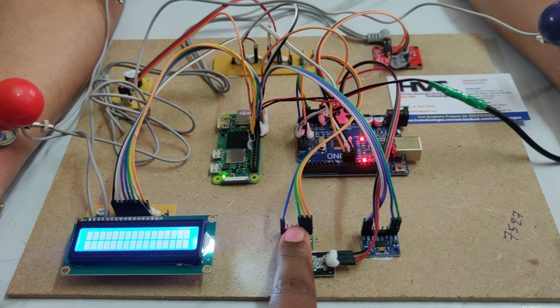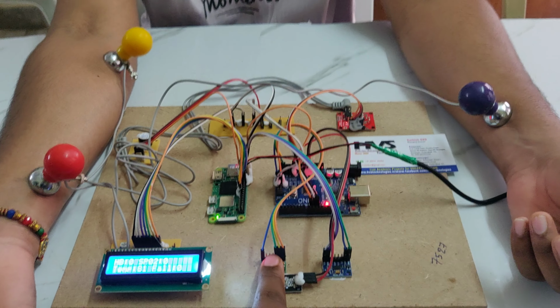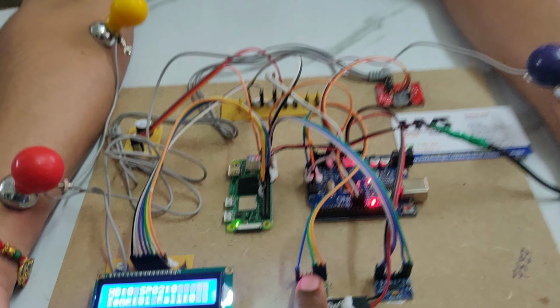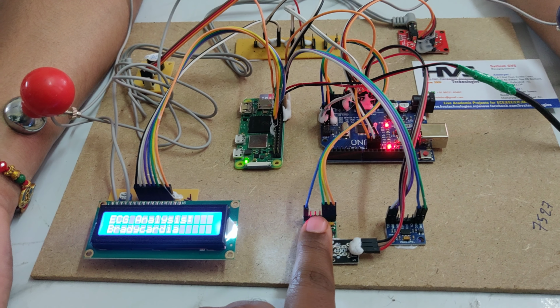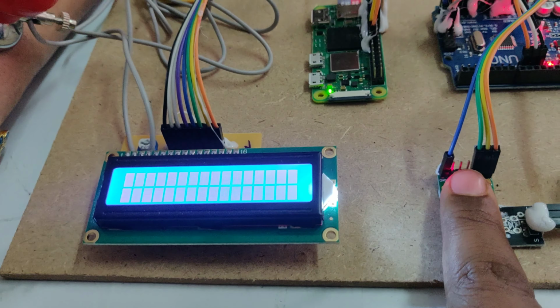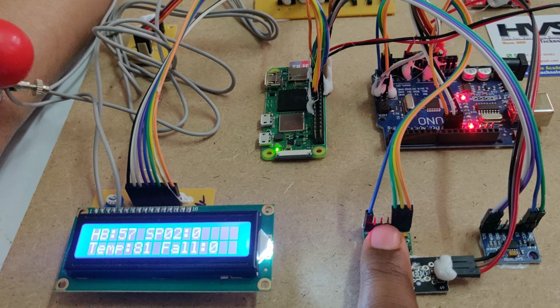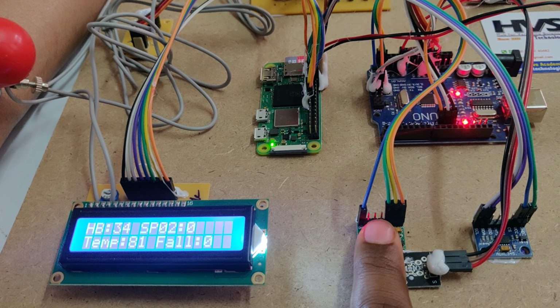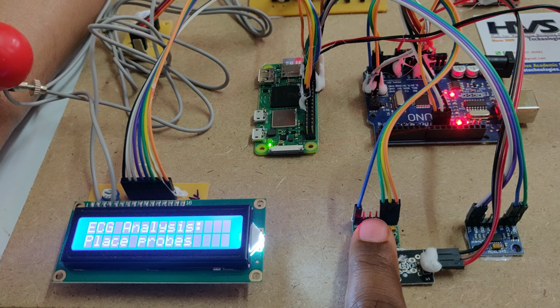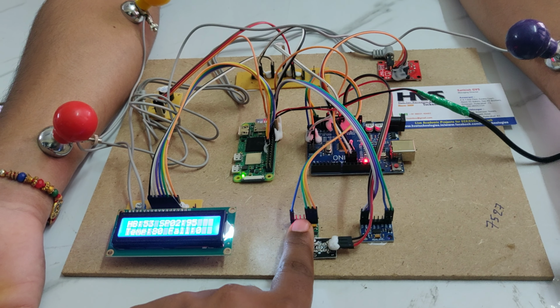So it's a normal ECG now. If there is any abnormality, like if you manually create some conditions, then the system will show it as detected. So it's a bradycardia disease. We are moving it, making something abnormal. There you can see heart rate and temperature will be calculated. If we don't move the finger, we place the index finger over there.